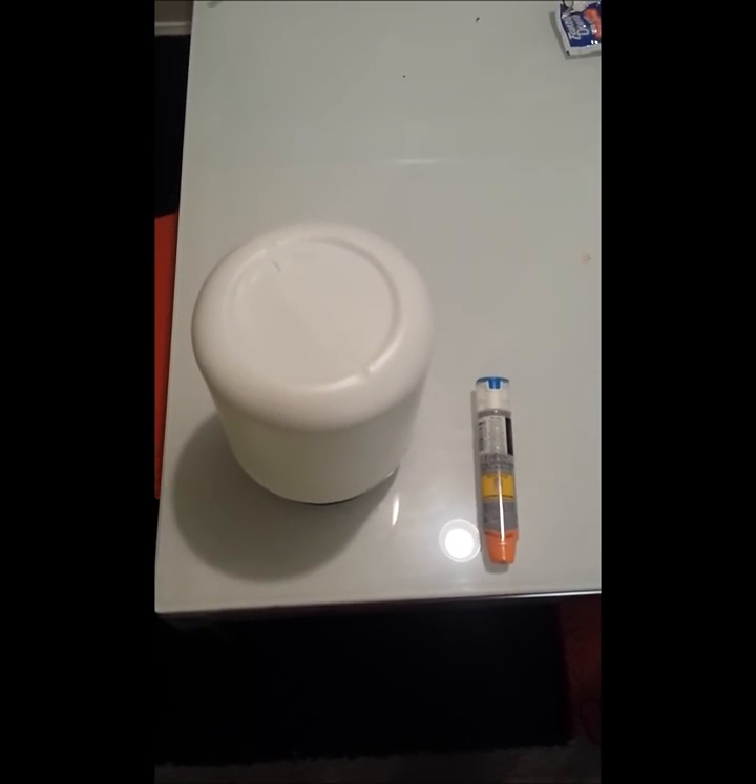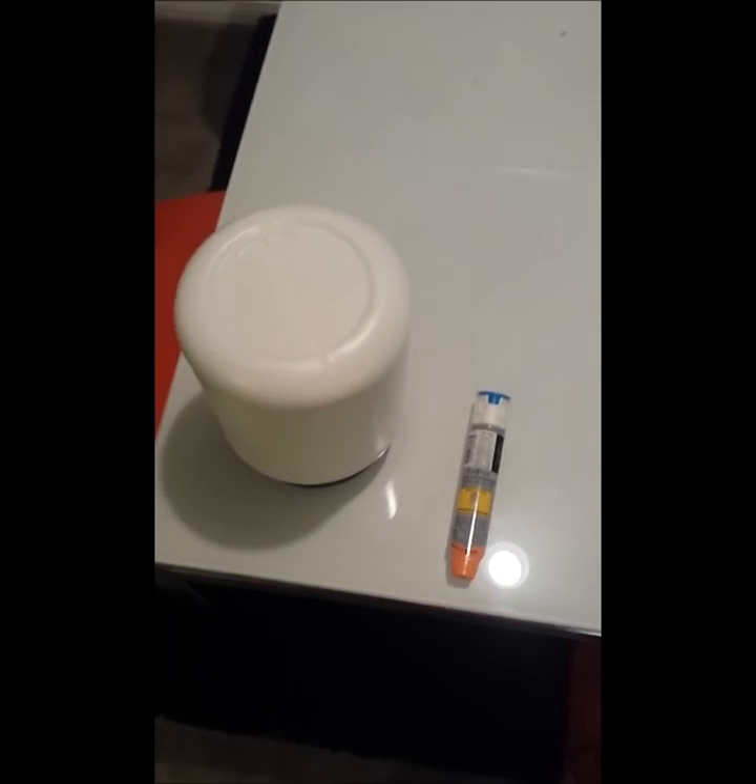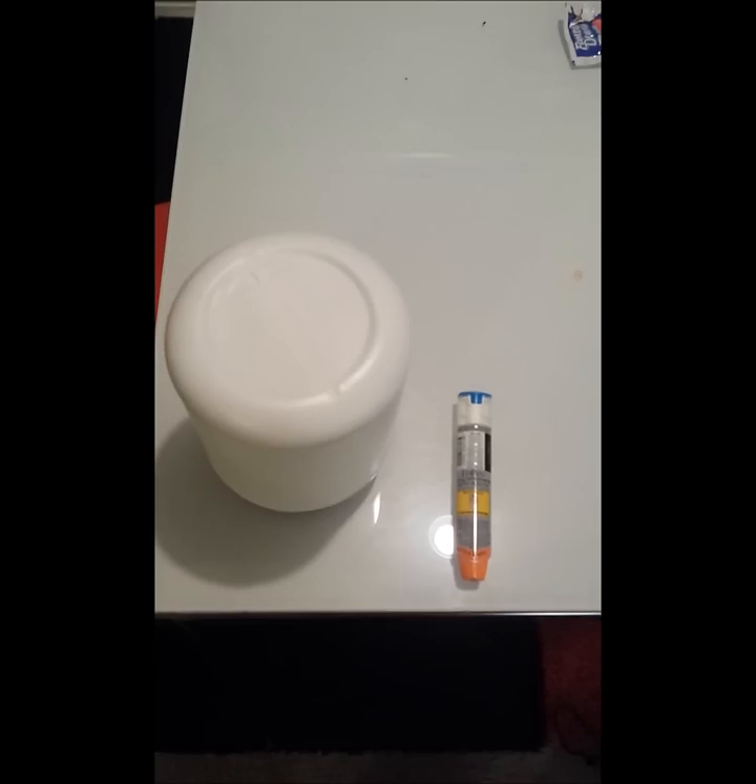I've got a lot of friends that have been asking me what the EpiPen looks like when it's used, how to use it, all of those sorts of questions. So I've got an EpiPen and I've got an old Muscle Milk container here, so let's give it a shot.